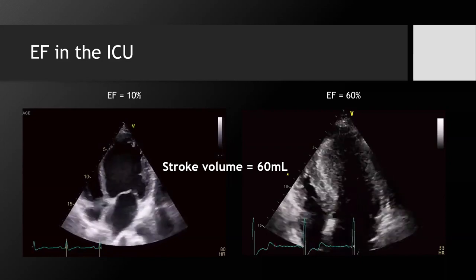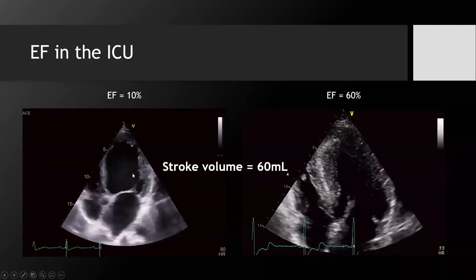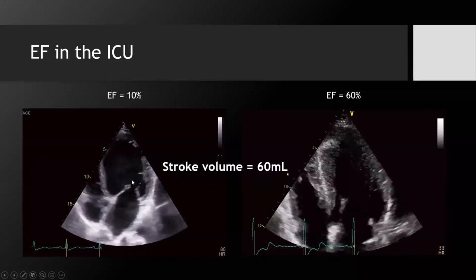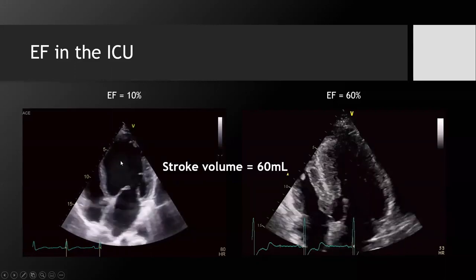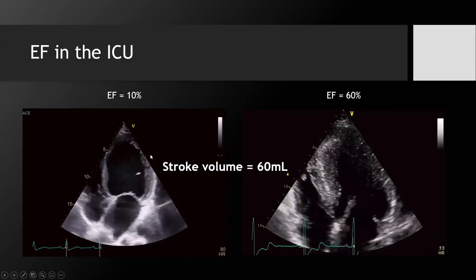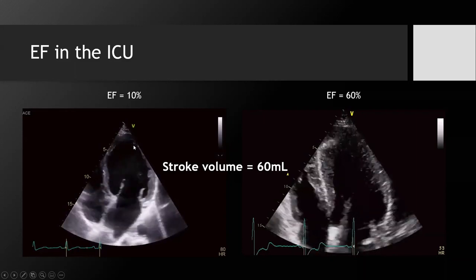Is that haziness stasis? This haziness here, it could be. I would be careful about that. I think it could just be a little bit overgained as well, but it could definitely be, because you would expect that with such low function. Chris was asking if this echogenicity here is stasis, and it could be. We would have to just be careful. All right, so that's one application.